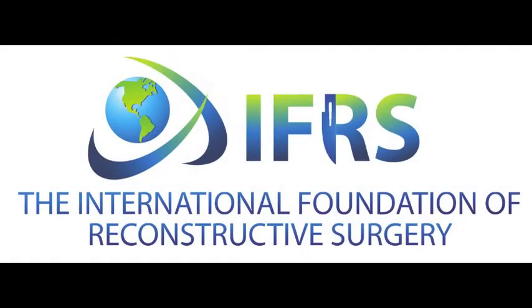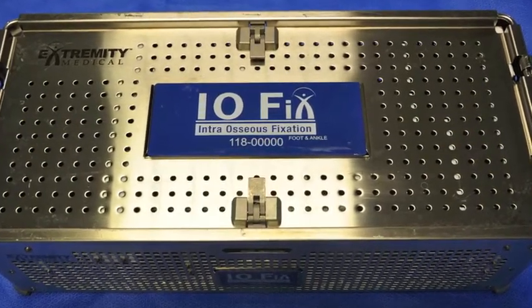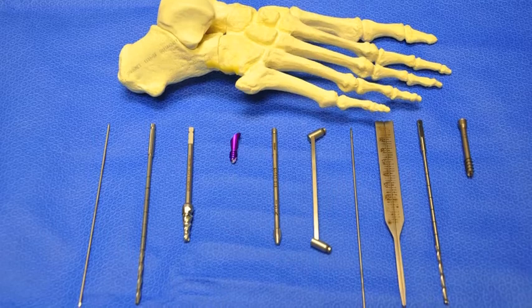Today's video is brought to you by the International Foundation of Reconstructive Surgery. The Extremity Medical Iofix is a very unique implant, and in this video we will demonstrate the sequence for insertion.